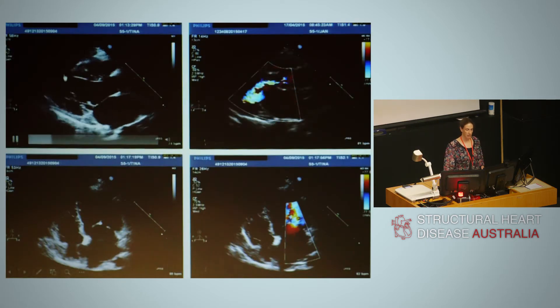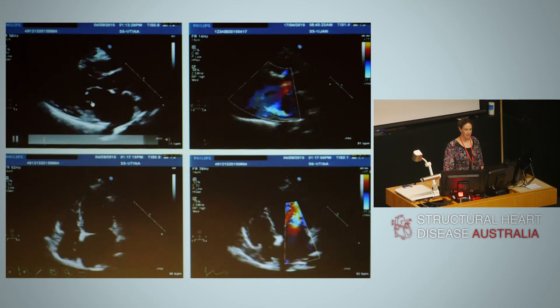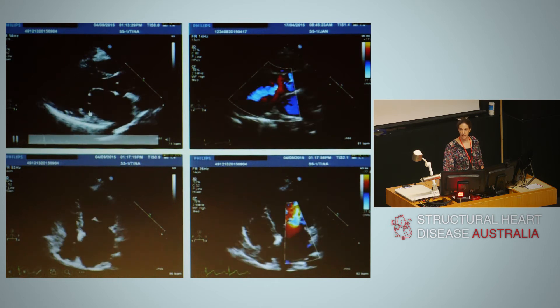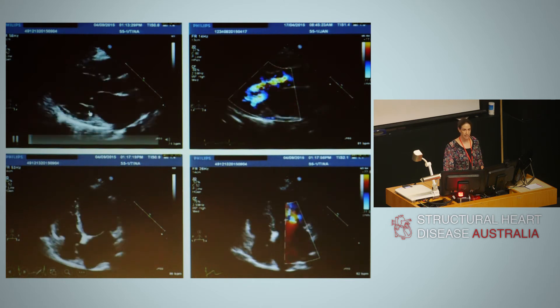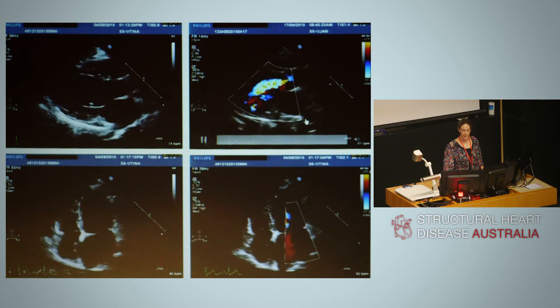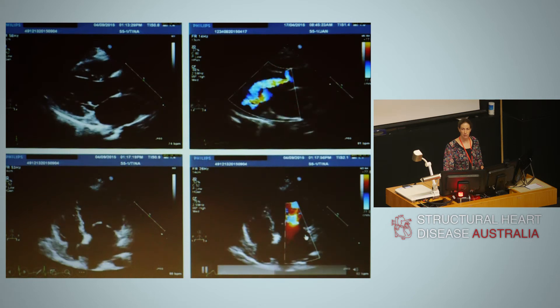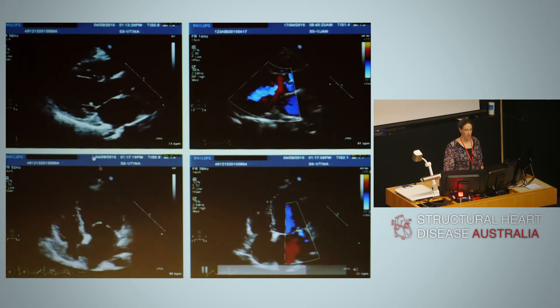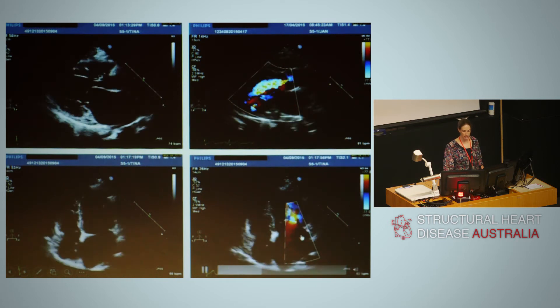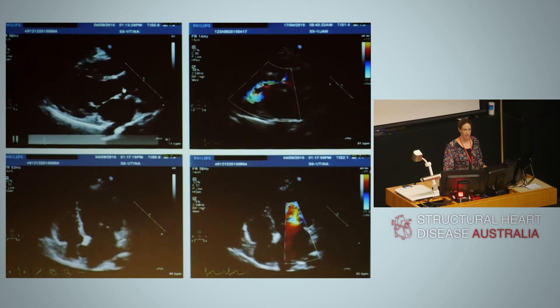In parasternal long axis imaging, we're looking at the mitral valve leaflets. We can see the anterior leaflet tip is relatively immobile, with a typical hockey stick deformity of rheumatic mitral valve disease. There is a relatively small regurgitation jet in parasternal long axis and in the apical four-chamber view. Along with regurgitation, there's obstruction to mitral inflow — mitral stenosis — the left atrium is dilated, and there are rheumatic changes in the aortic valve.